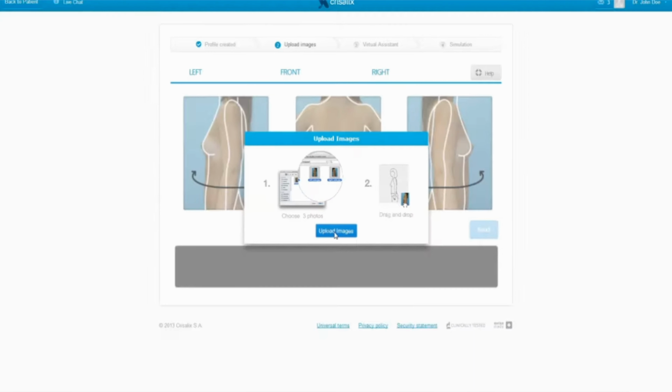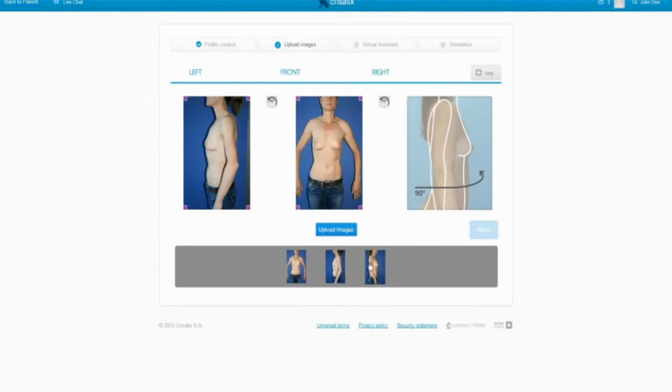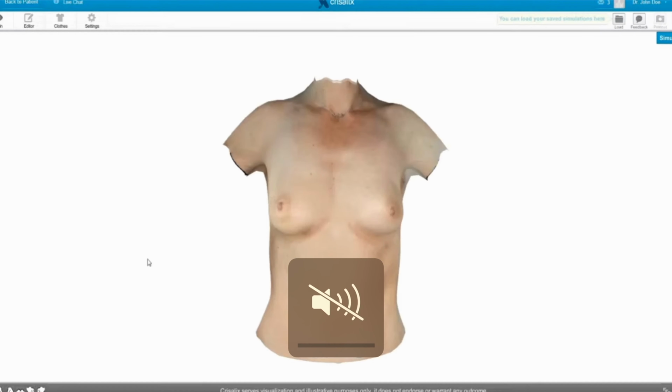Now when it comes to the breast, the main type of surgery which we do as plastic surgeons is breast enlargement. Breast enlargement patients want to know whether the implant you have chosen is going to match. So what we do is take the pictures, feed them to the software, and then the software renders many images depending on the volumes we choose.